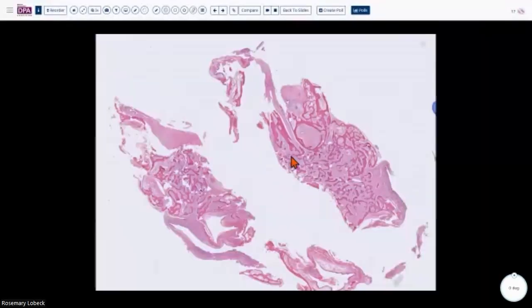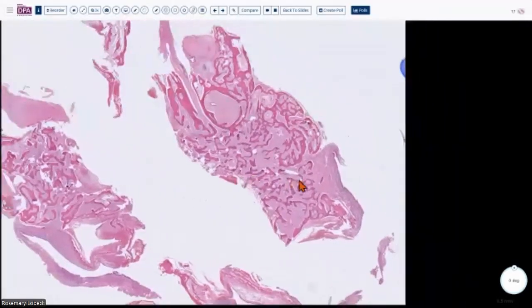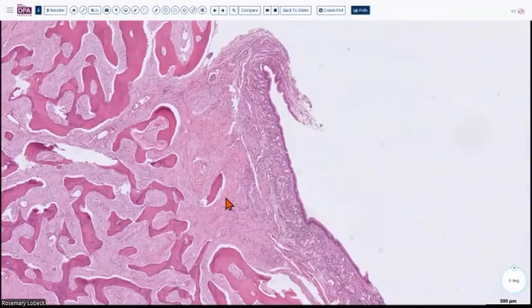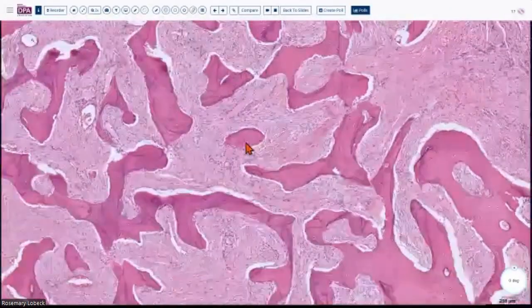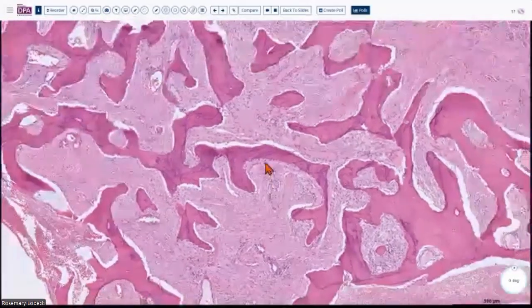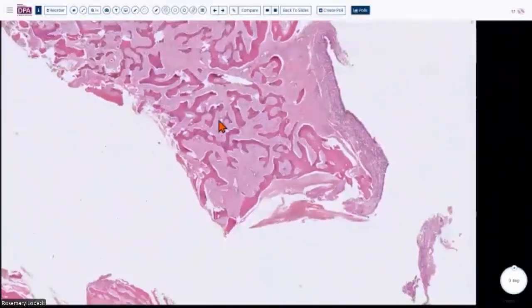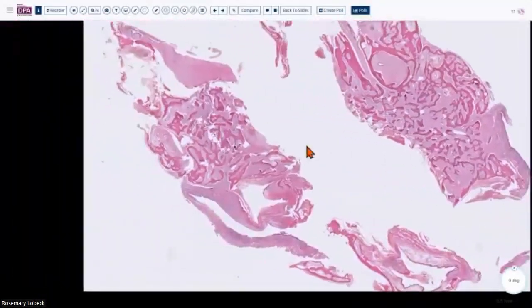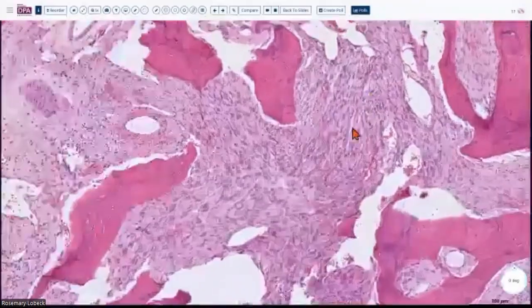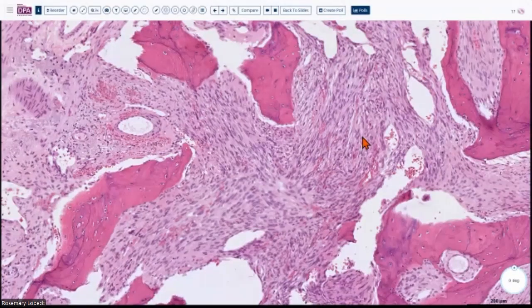All right. And then the other thing about low-grade osteosarcomas is that they can metastasize, right? Even when they are in the low-grade state, they can metastasize. So I want to show you an example of that. So here, just so you will believe me, this is actually bronchial epithelium, right? So this is in the lung, and we can see similar type of very, very low-grade, bland-appearing fibroblastic proliferation and these bony strands. So this is metastatic low-grade osteosarcoma in its low-grade state. However, most of these cases do dedifferentiate before they metastasize. Even in this case, you could see there is higher cellularity in this particular area, so it's on its way to becoming dedifferentiated.